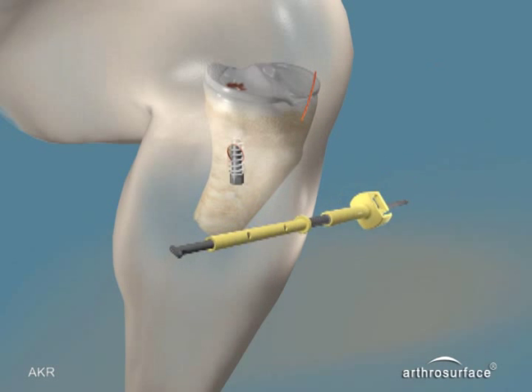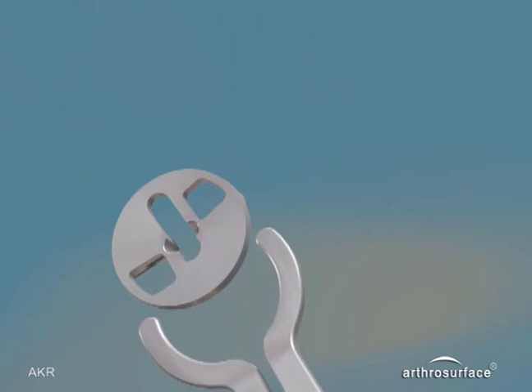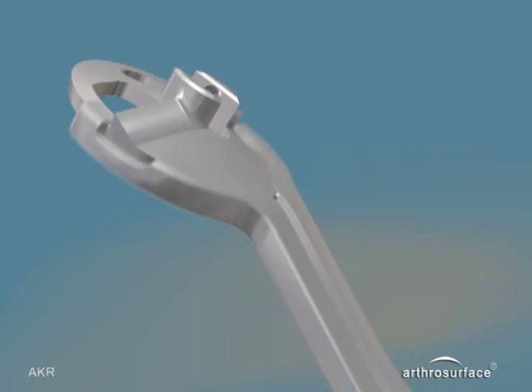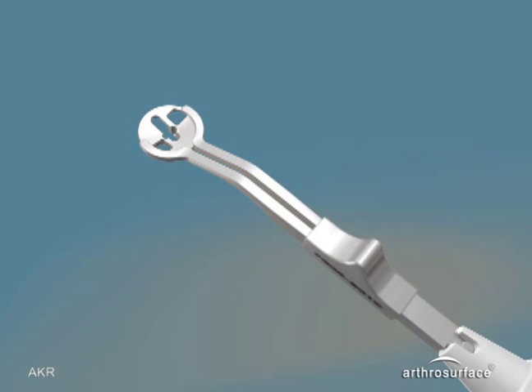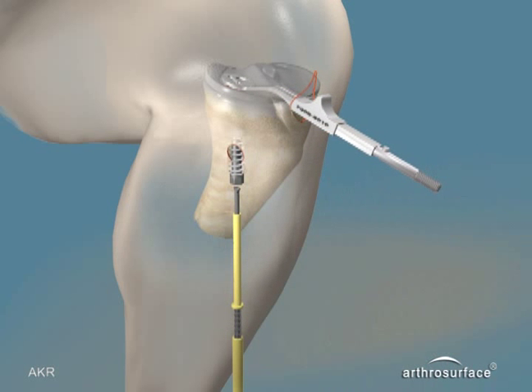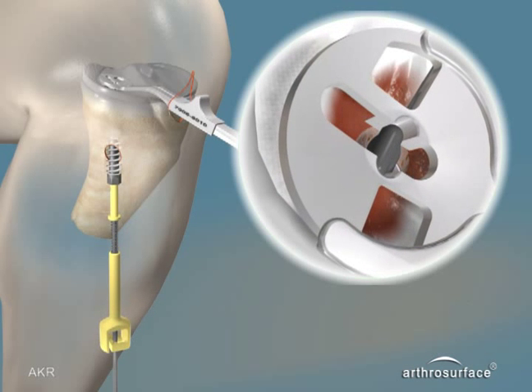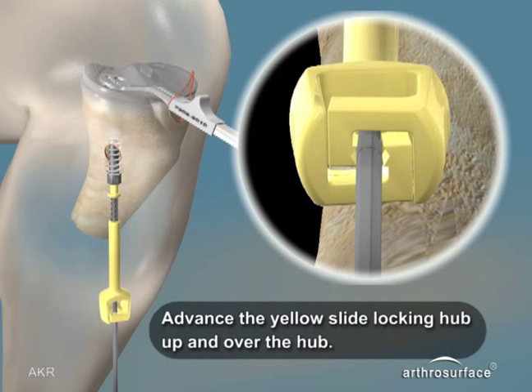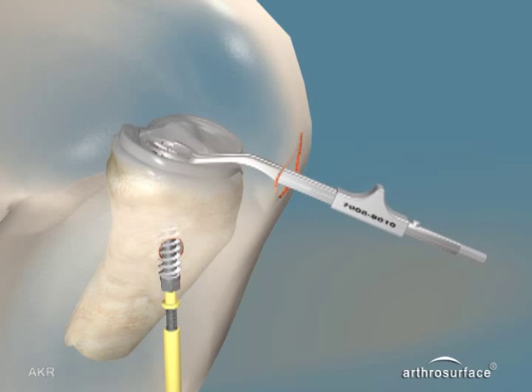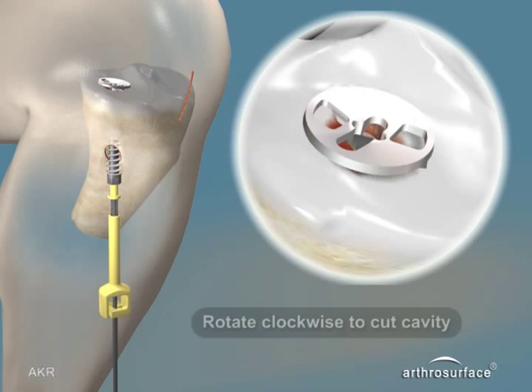The tibial cutter shaft is then inserted through the blade stop and the tibial cutter blade is inserted into the blade holder. The longer longitudinal slot should be facing posterior on the blade. Advance the tibial cutter swivel up and through the center of the blade, then rotate the shaft 90 degrees and pull back. To lock the blade, advance the yellow slide locking hub up and over the hub and release the lock. Remove the tibial blade holder.